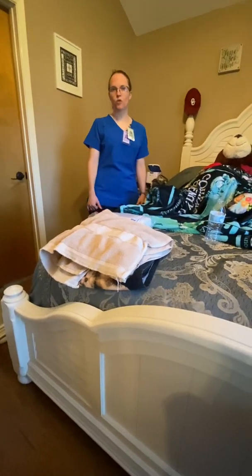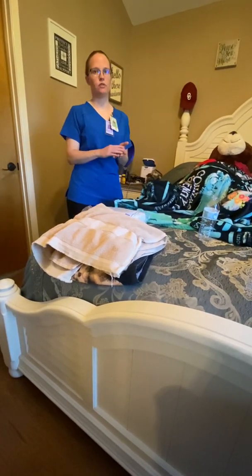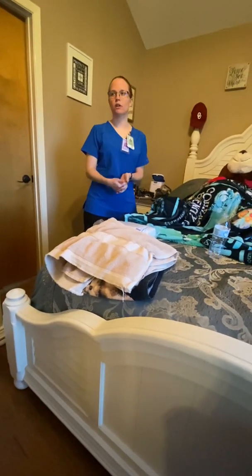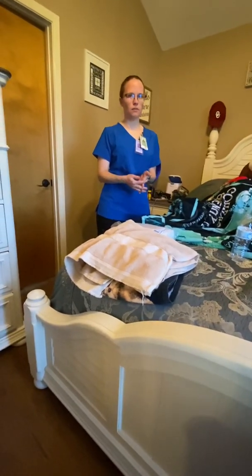Today we're going to be performing urinary catheterization on males and females. What we would do first before we enter the patient's room is we're going to perform hand hygiene. That's what you always do before you enter a patient's room. Next, we're going to verify there's documentation for the procedure to be performed, documentation by the physician.